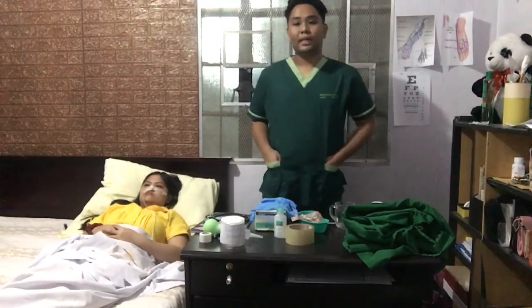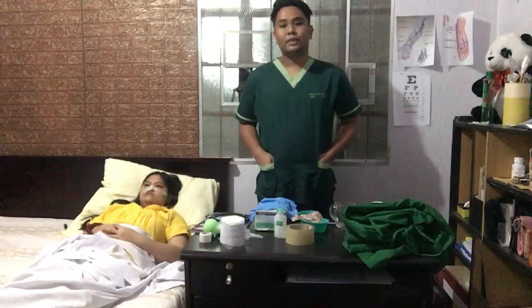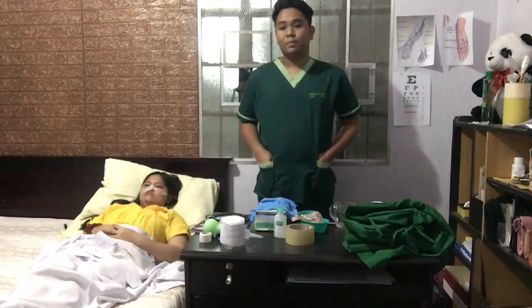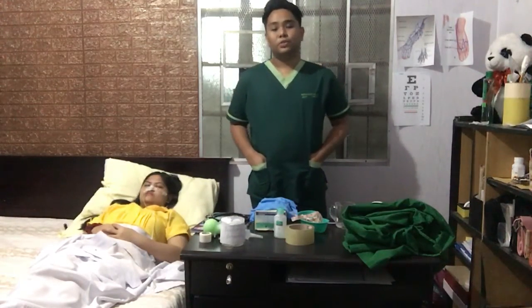So for the assessment po, i-assess po natin yung abdomen niya by inspecting the presence of distension, auscultate po natin yung bowel sounds, and papalpate po natin yung abdomen for firmness or tenderness. Then, assess po natin yung patient or yung family understanding po for their level of consciousness and also the level of understanding. So, i-address natin yung mga concerns o yung mga questions nila by explaining yung mga nursing intervention na gagawin natin during the procedure.